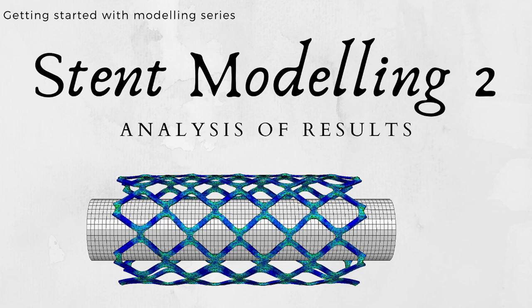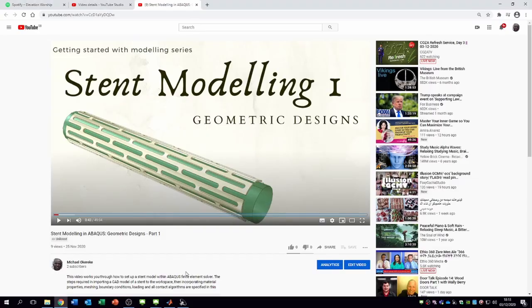This particular video is modeling two and I'm going to be focusing on analysis of results from simulations of a stent after it has been deformed and expanded by a balloon and the balloon has recoiled. You need to look at the first part of this series - stent modeling one on geometric designs - to understand what we are trying to do with this second video.